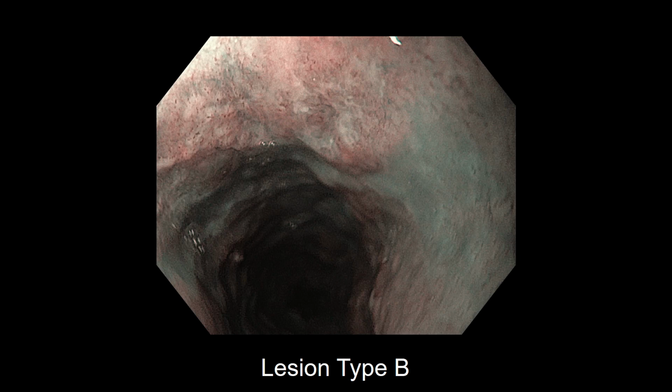Closer view we don't have. And then another point is the irregularity of the surface structure becomes worse than the previous image. So this part may be the deepest area. So for you, a very important point would be that when the vessels are really huge and enlarged, then it's a definite submucosal invasion, but in this case, it's not so sure.